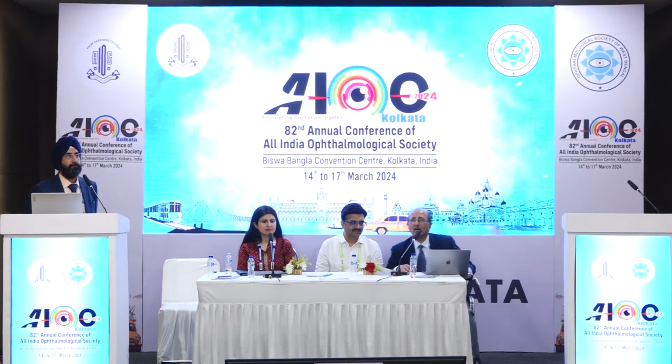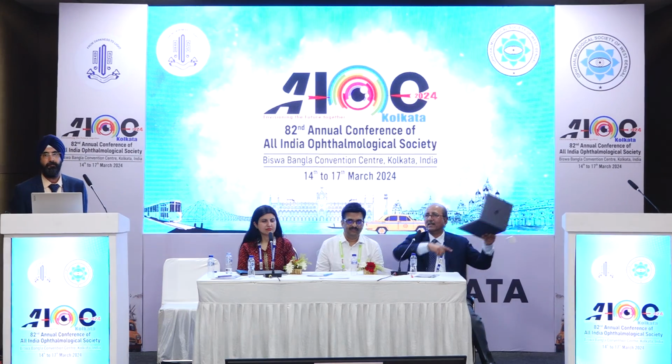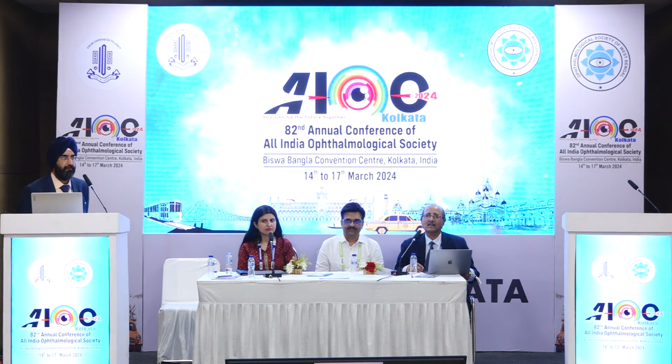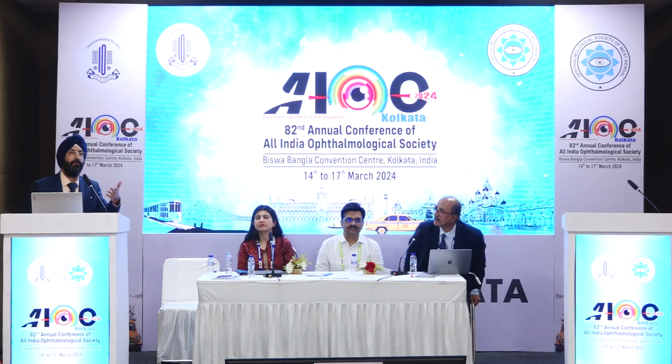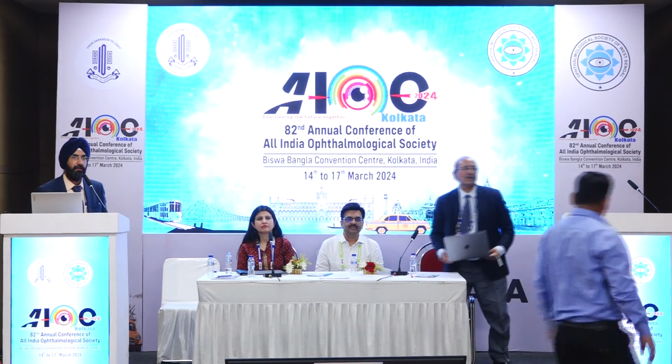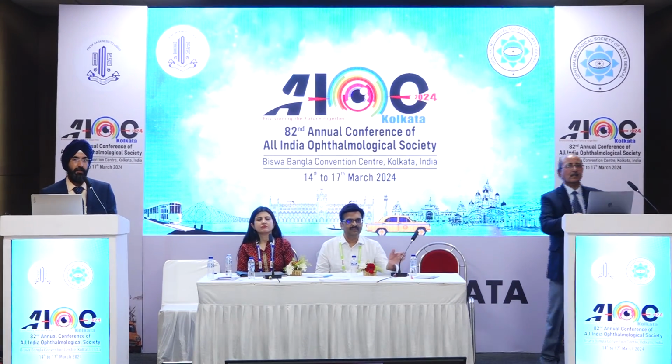Any question for Dr. Jaspreet? In between, I think while my slides will be on, I think ask question. They want to have questions. Is it there's a three-piece IOL that you capture behind the PC?